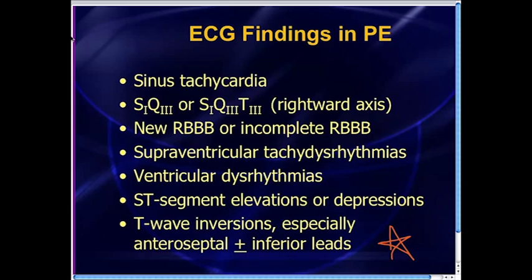And when you look at the EKG literature, which just looks at large pulmonary emboli, what you find is that new T-wave inversions may very well be as common, if not more common, than sinus tachycardia. Again, in cases of large PEs, flipped T-waves are fairly common. Maybe as many as 50% of patients with large PEs will show up with a new T-wave inversion or new T-wave inversions in an anatomic area that make you think that they're having ischemia.